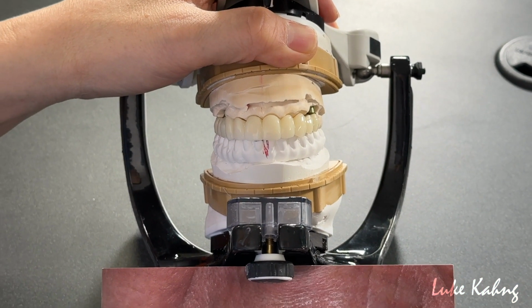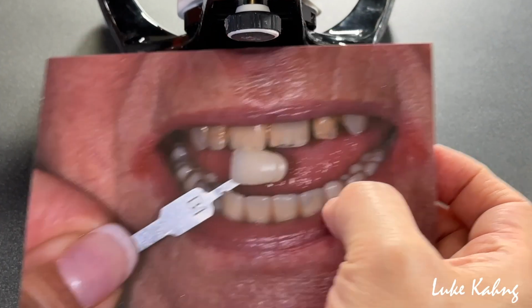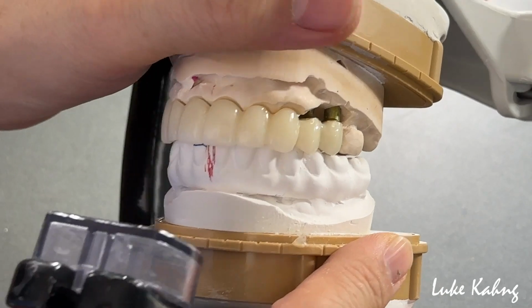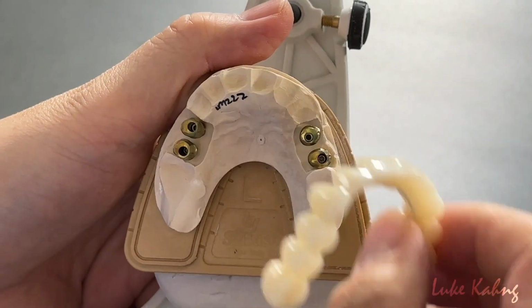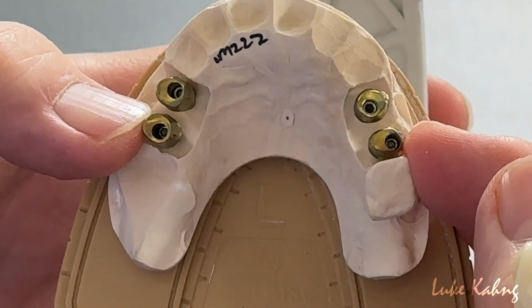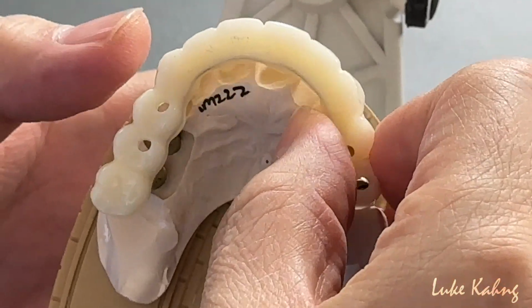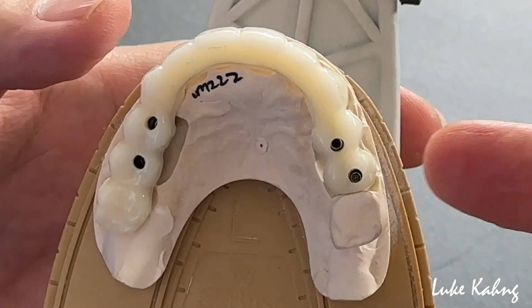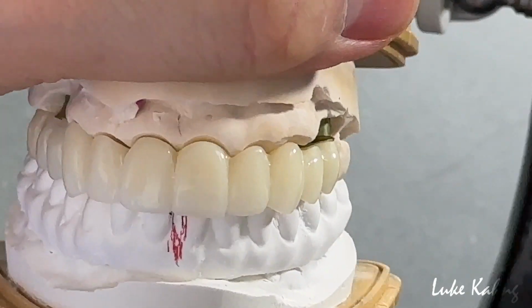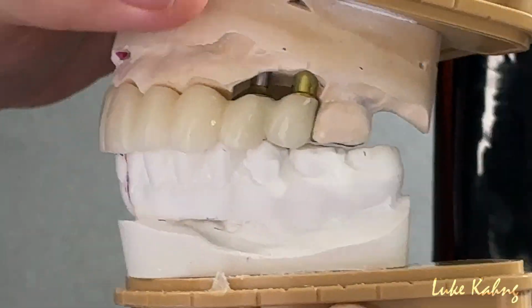The lowers, the previous patient has it. Okay, it looks like the lower is zirconia here, and then the upper I made a little bit bigger than normal, and this is what the final will be. The doctor will go into cement and put it into this one first because I cannot cut it at the hex area, and then I have to put it in the mouth, and then they try this, and then I have to hold out the teeth, and then they put together, and then they temporarily cement or cement it, so they can check the bite, and they can let us know the final tooth preparation, the future case.